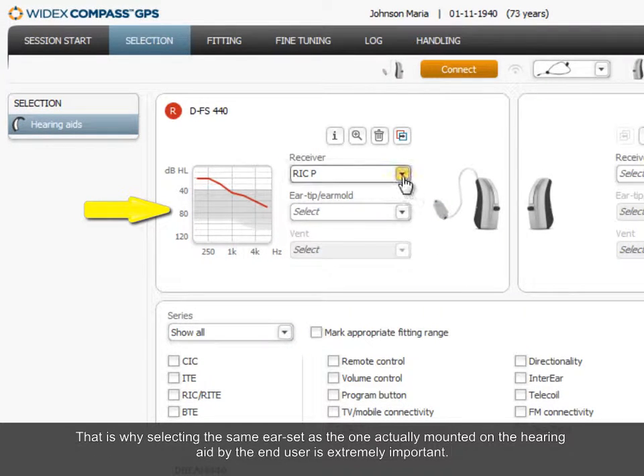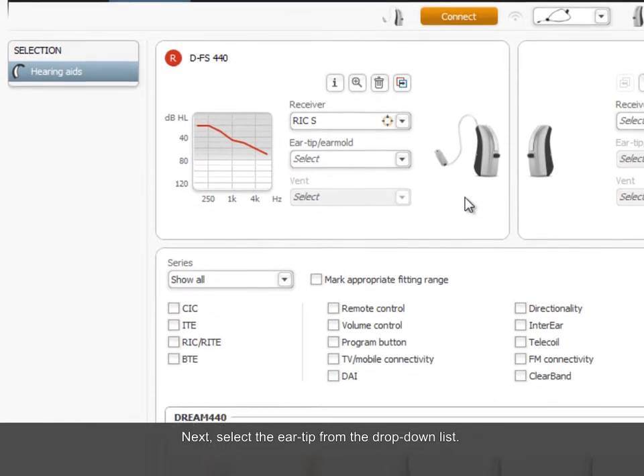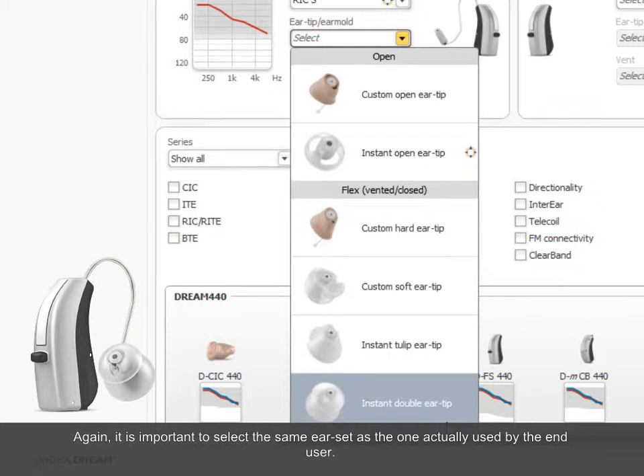That is why selecting the same ear set as the one actually mounted on the hearing aid by the end user is extremely important. Next, select the ear tip from the drop-down list. Again, it is important to select the same ear set as the one actually used by the end user.